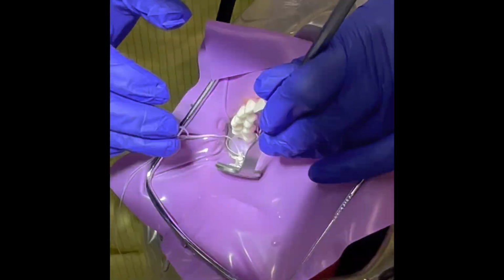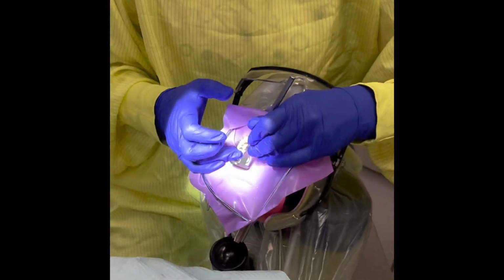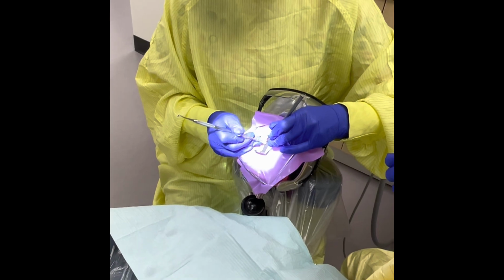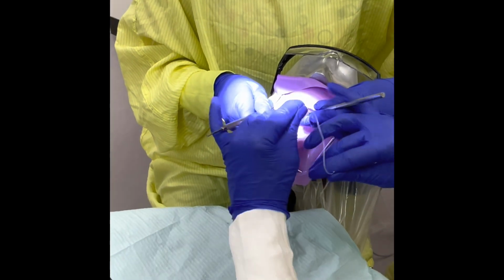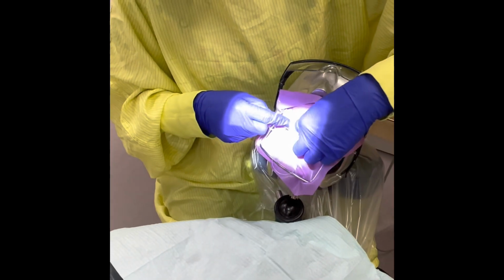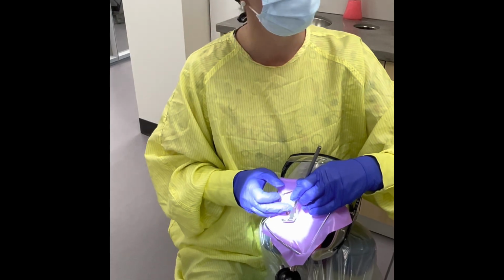Okay, so the next thing I'm going to do is just take another carver, please, Stacy. What carver would you like? I'll take my disc end of my discoid cleoid. Okay, please. Thank you. Okay, so we are going to check the interproximal on that. So I'm going to pass her my unwaxed floss again. Good. Oh, and that's wonderfully smooth. Is it smooth, Stacy? Good? Thank you. Awesome. I'll take that back. Here's your mirror. Okay, and we are ready to remove the dental dam.